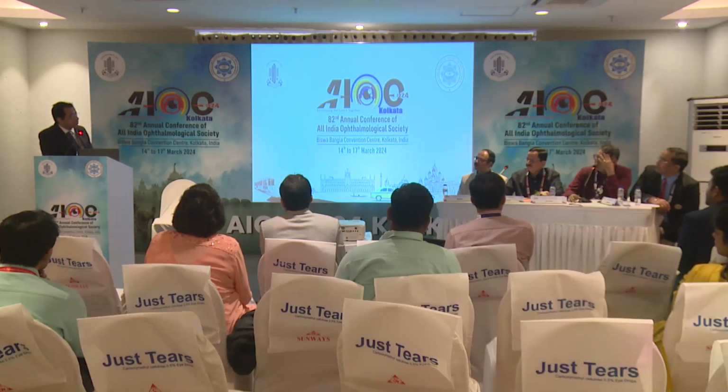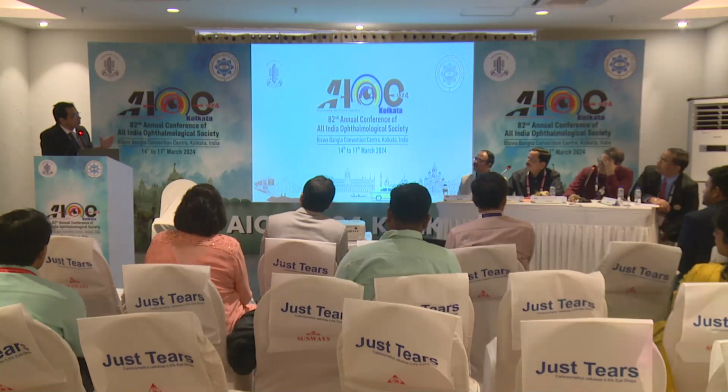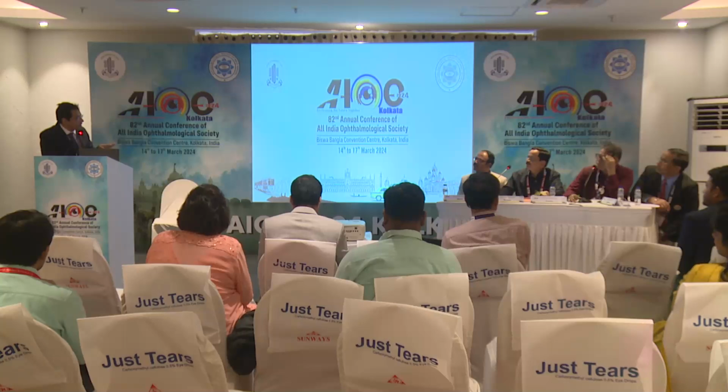Now the outcomes in this series were very good because we just closed immediately, and the hemorrhage was in a localized area. If you continue with the surgery, it's going to expand, and if you still don't realize, it could end up in an expulsive hemorrhage as well.